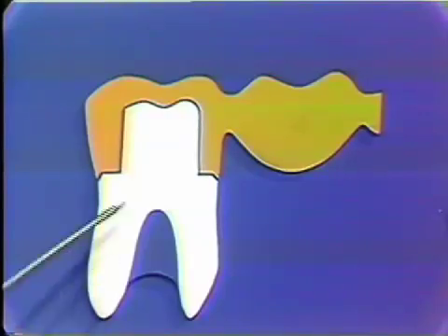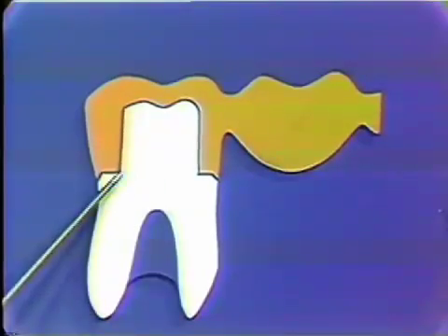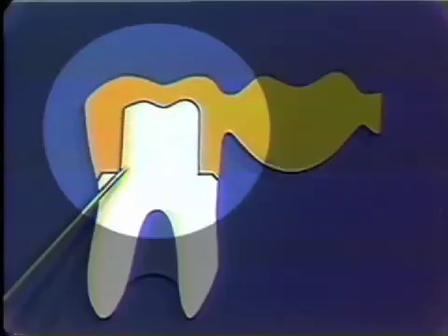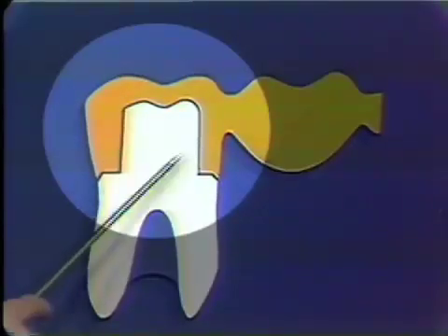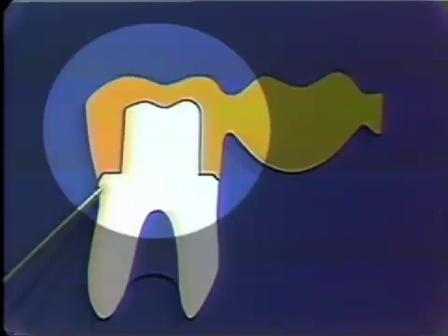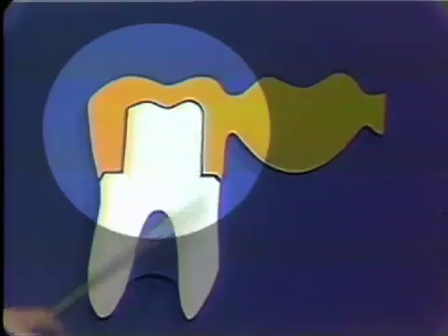And it is this quality of a retainer which is most important to recognize: the adequate length here and the absence of marked taper on mesial and distal surfaces here, so that it has a mechanical design in which attempted movement of this subjects the cement lute to compressive forces and not to tensile stresses.